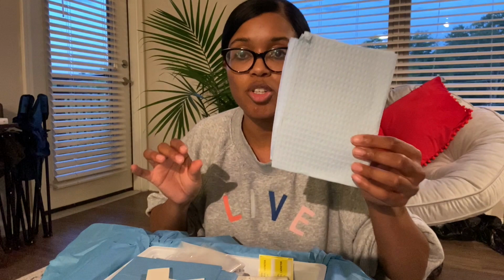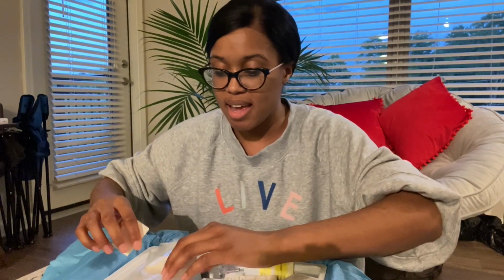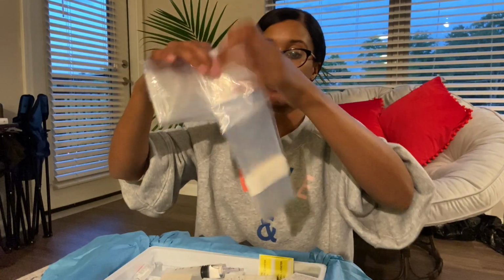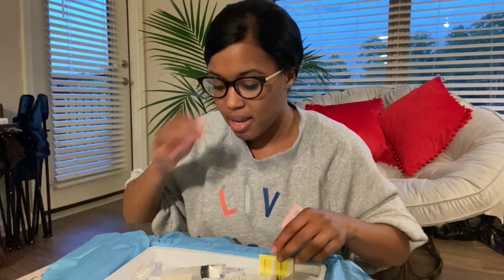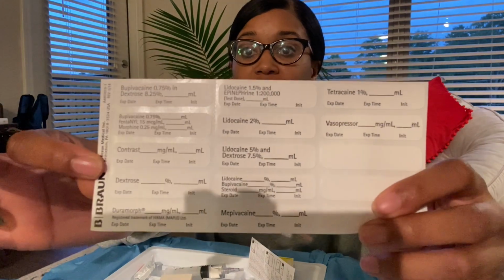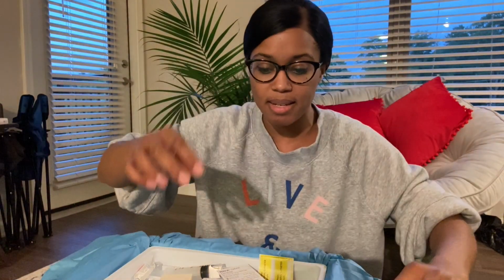We have some little papers that we can put under the patient, just to create more space for us to do the epidural. And then this is a little plastic sterile drape that we put onto the patient's back, and it has a little circle that's open, and that's where we would be inserting the epidural. So that's the sterile drape. And then we also have labels, so we can label our medications that are inside the epidural kit.